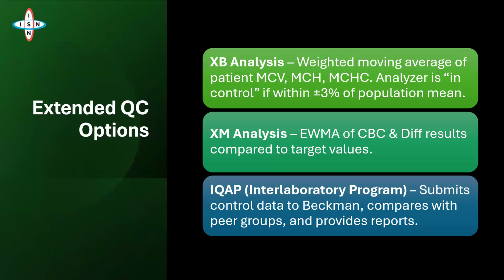So when you use a flash, you designate a flash which you will use to export your files and then send them to Beckman, and they will compare it with other Beckman users, and then they will provide reports of the quality control analysis, the quality control report, sorry.